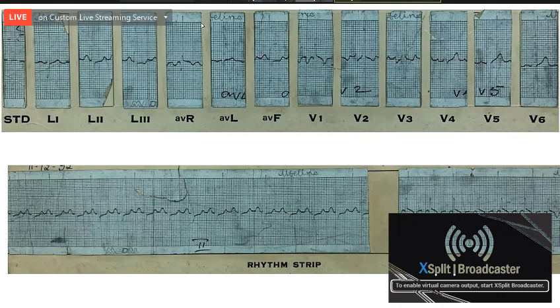Right axis deviation. Yeah, right axis deviation, very good. There is left atrial enlargement and RVH. Is there a right atrial enlargement? No, sir. Borderline, if at all. Okay, so there's left atrial enlargement and right ventricular hypertrophy.